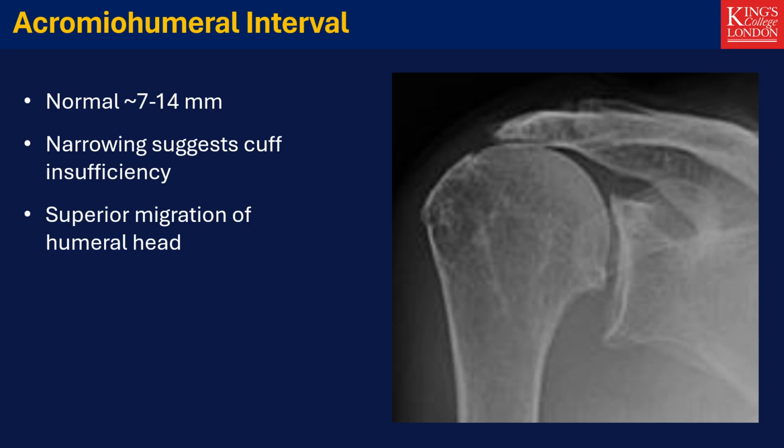Orthopedic surgeons in some countries are using this to diagnose rotator cuff tear prior to surgery rather than ordering the more expensive magnetic resonance imaging.